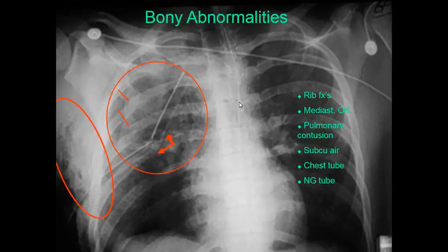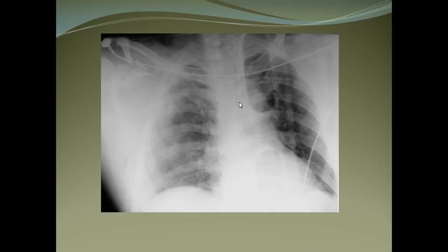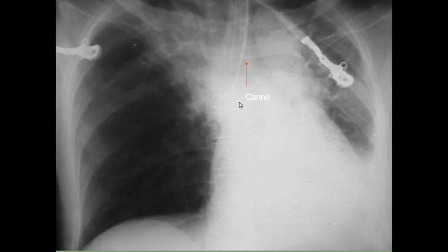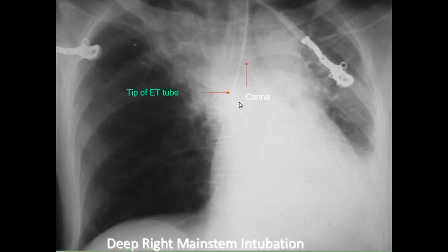In your exam, you have to identify and comment on everything you see. Pulmonary contusion appears as opacification of the lung. You can also see scapular fracture, the carina, and the tip of the endotracheal tube.